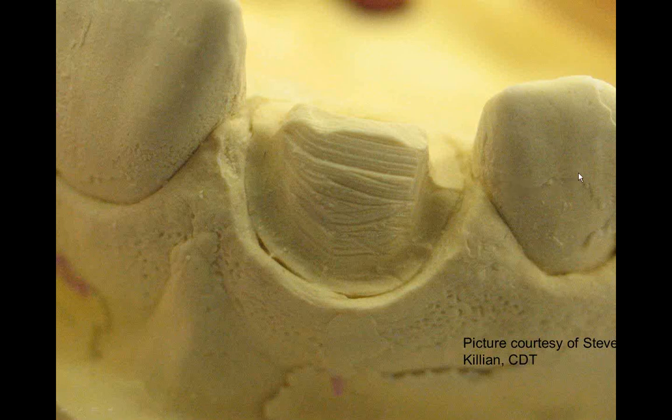If you look over here to the side, you can see this looks like it's been laid over the top of this tooth, and it's happening on this side too. So we'll call that a double impression. What that means is that somewhere somebody pushed and then backed off again. That could very well mean that this is also distorted.